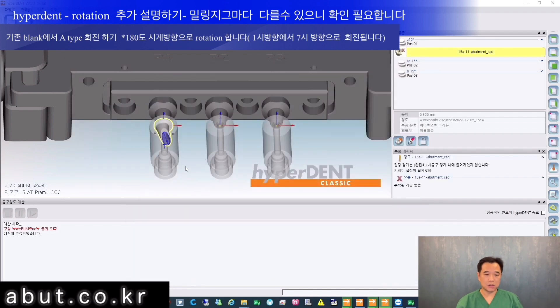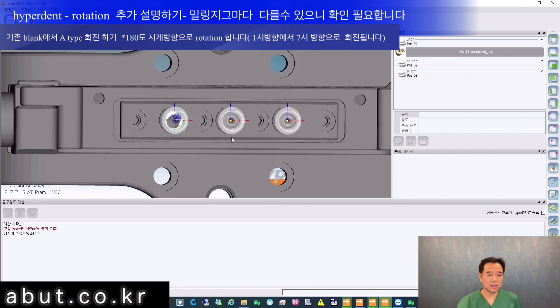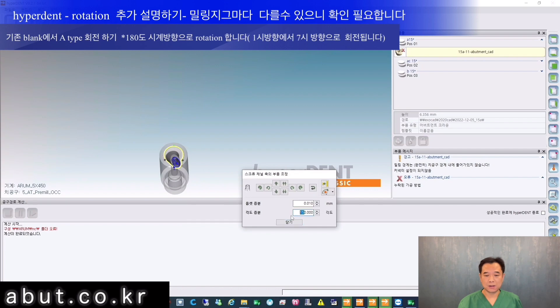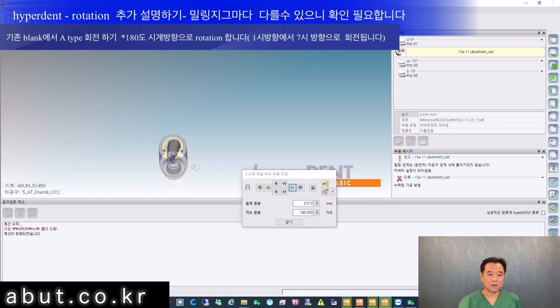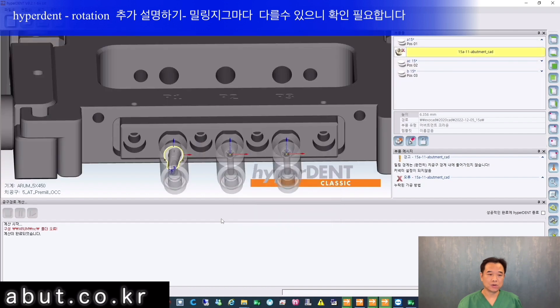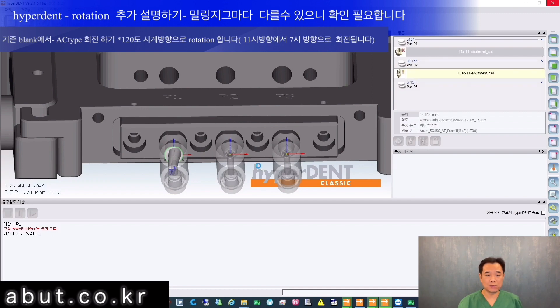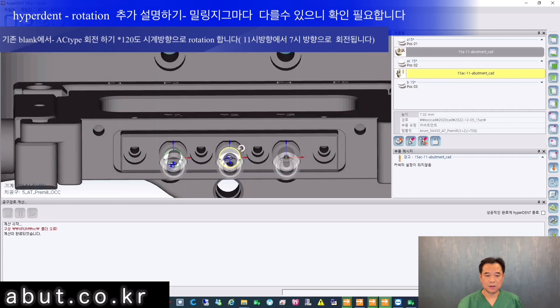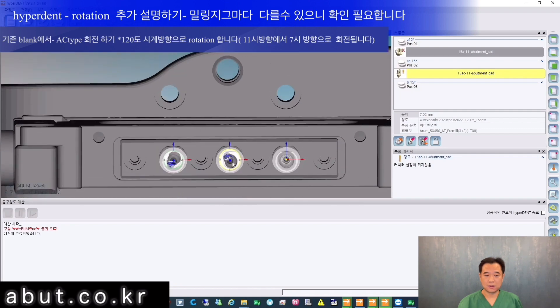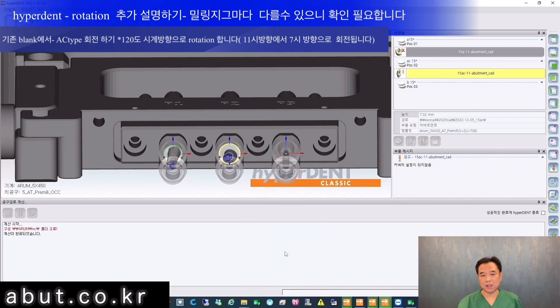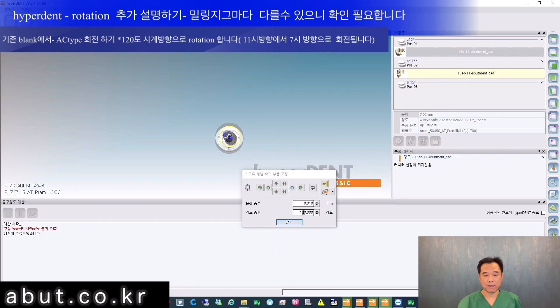We will look more specifically into Hyperdent, covering Type A, Type AC, and Type B using the existing blank. For Type A, adjust the STL to 180 degrees from the indentation facing forward, then click clockwise rotation. Note that the clockwise direction is based from beneath the abutment, so it rotates counterclockwise when viewed from the occlusal surface. For the AC type, set to 120 degrees then select clockwise rotation — it rotates from the 11 o'clock direction to the 7 o'clock direction. The A-type abutment blank is used for both A and AC types.